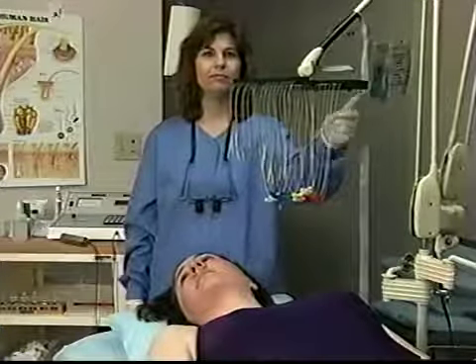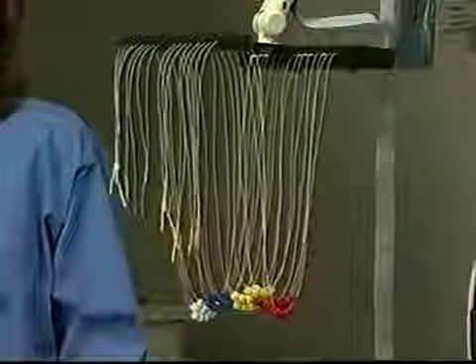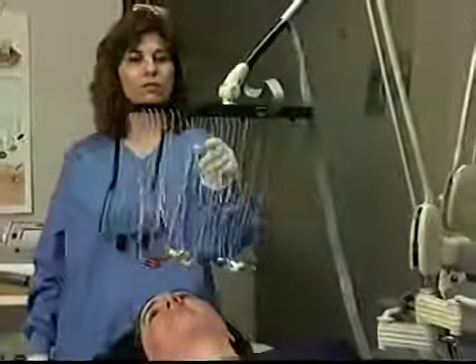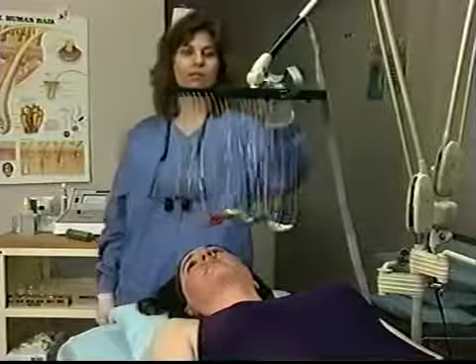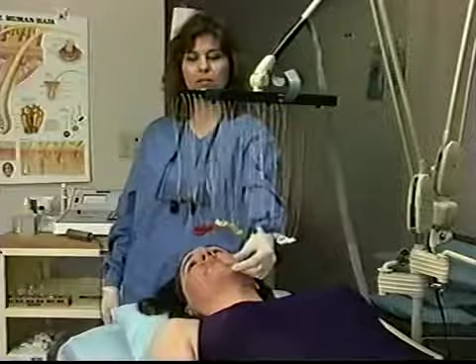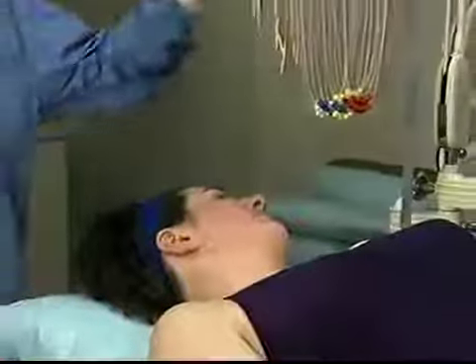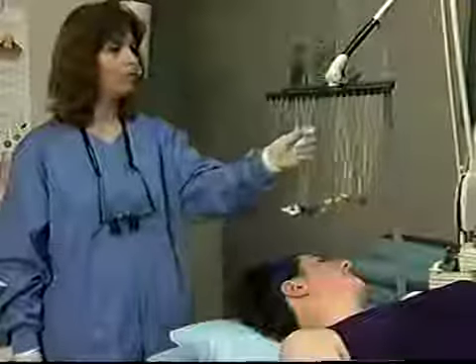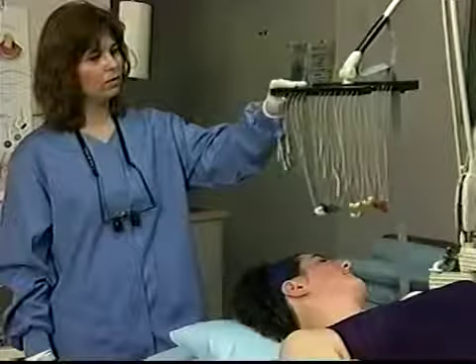For the left cheek or sideburn, position the rack so that the back is over the edge of the table. For the left upper lip, rotate the rack so that the back is over the body of the patient, and the front is in line with the treatment area directly over the upper lip. With a slight adjustment, this position can also accommodate the lower lip and chin. For the right cheek, the right sideburn, and the right chin, rotate the rack so that the back is over the head of the patient. This position is also good for the right ear.